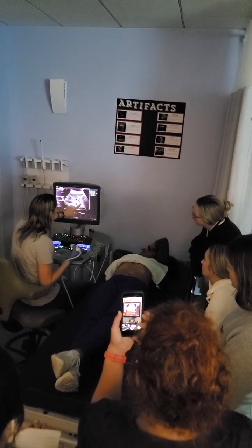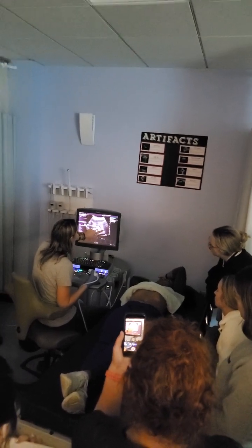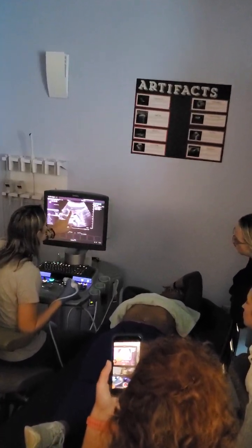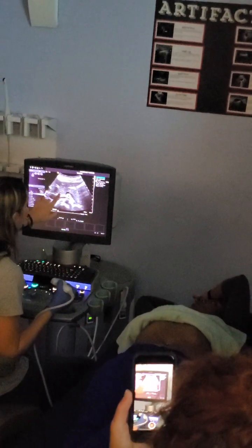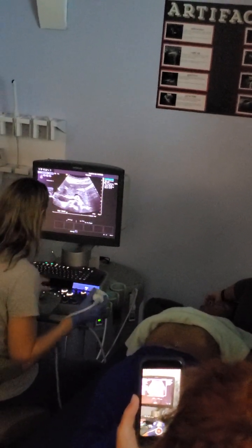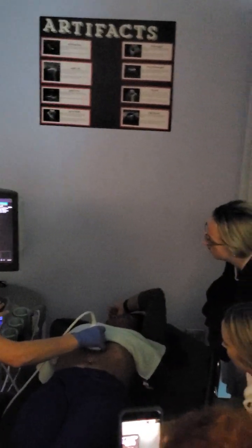So here's the tail right in here. And then we're a little bit obstructed, and we'll kind of get into how to fix that in a second. So we have tail, body, neck, head, and a little bit of that uncinate. So this would be a good image maybe for our head, but not so much our tail. Go back down to pancreas.